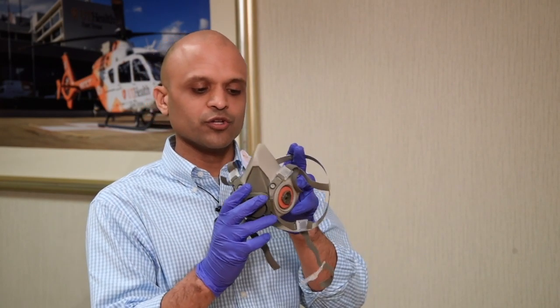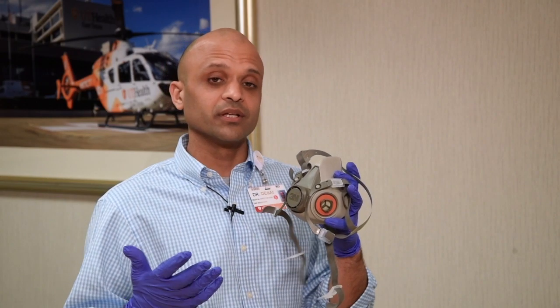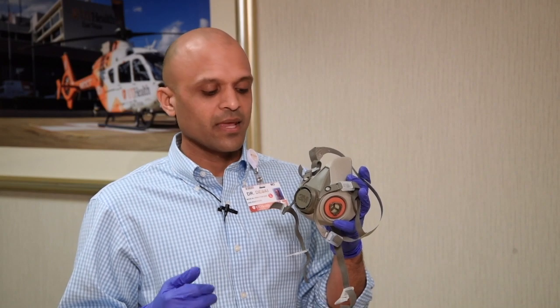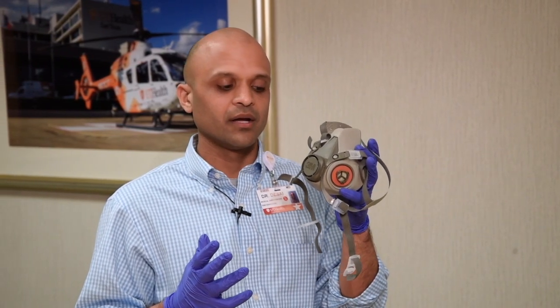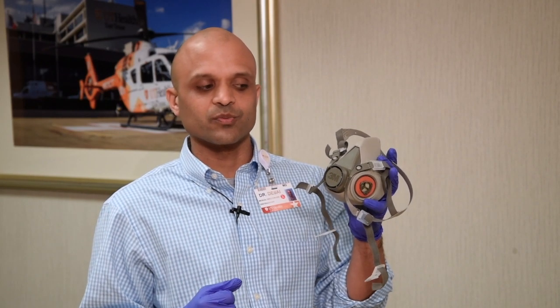These masks are reusable. The cartridges will last a long time — if you start noticing difficulty breathing, that's the first sign a cartridge needs to be changed. However, these cartridges are designed for environments with very high particulate matter in the air, and we're seldom in those sorts of areas, so these masks should last a pretty good long while before needing any replacement filters.